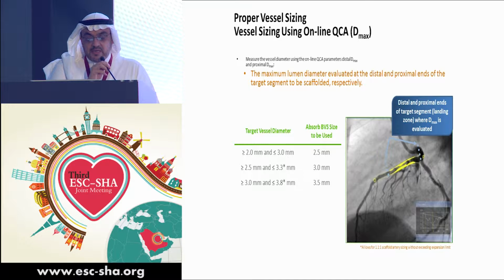So for the sizing, if the vessel size is, for example, between 2 and 3, we should use the Absorb 2.5. If it's between 2.5 and less than 3.3, we use the size of 3. If it's 3 to less than 3.8, we use 3.5. So this is the size. You have to respect the size here.